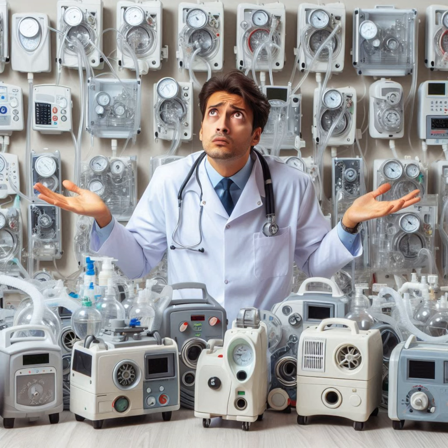Precisely. This article proposes using alveolar tidal volume instead, which focuses on the air that's actually participating in gas exchange. And they're using a technique called volumetric capnography to measure it, which tracks the carbon dioxide in your breath. So by zeroing in on the alveoli, we could get a much more accurate picture of how they're responding to the ventilator. Exactly. But how does this actually translate into protecting the lungs?